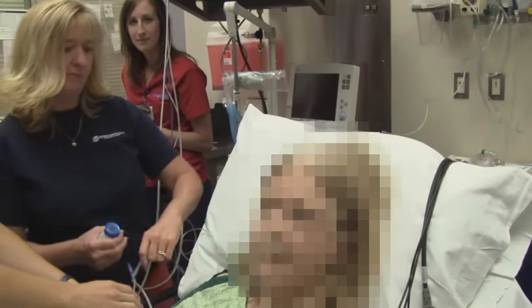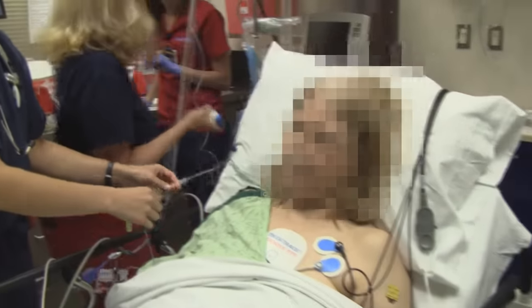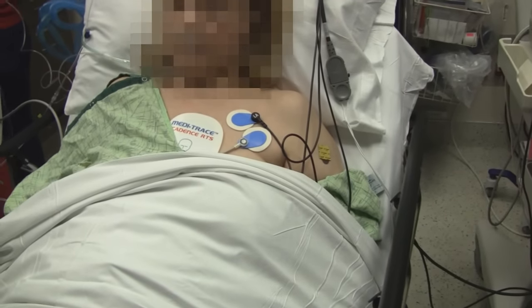You understand this will be on YouTube but your face will be blurred. Thank you. Now we actually have the pads on your chest already. Do you mind being on YouTube? Yeah, I don't mind. What voltages are we going to use? I believe we're going to do 50 joules. 50 joules? Okay.